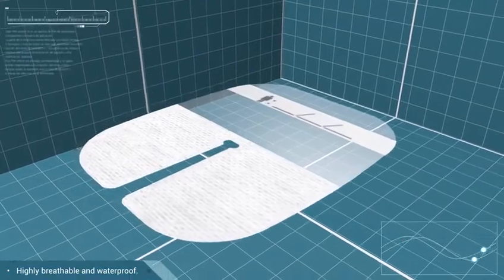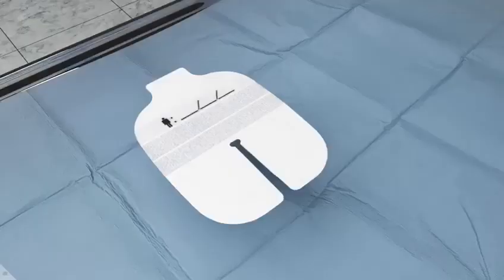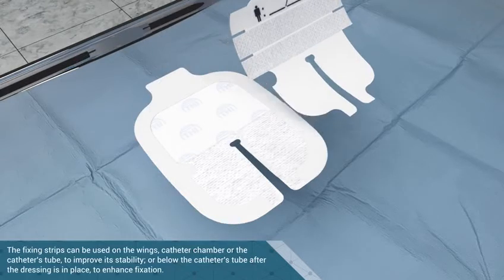This keeps the insertion site dry and minimizes the risk of infection. For placement, firstly remove the central part of the application frame, which includes the fixing strips, and place it in a sterile area.